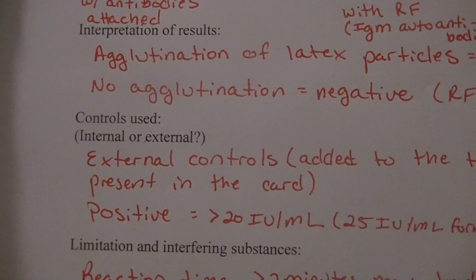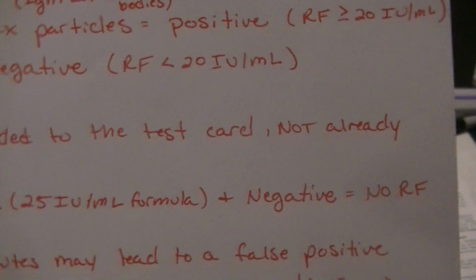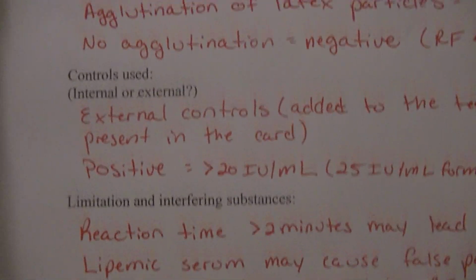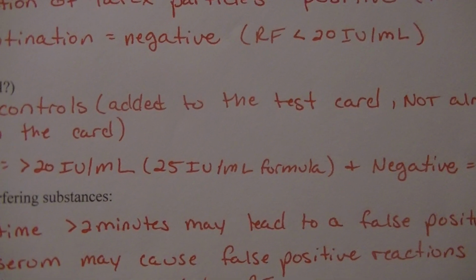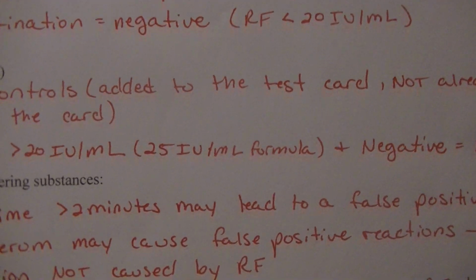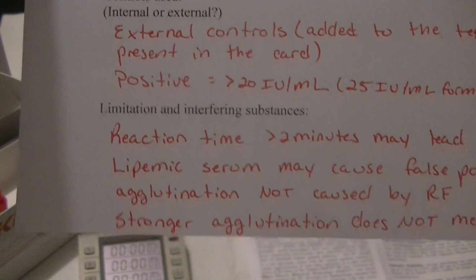Controls that are used. We used what are called external controls because the controls had to be added to the test card. They were not already present in the card when it was produced. Positive control, greater than 20 international units per ml. Specifically in this kit, there are 25 units of rheumatoid factor in the positive control, and the negative control has no RF, so it gives us a negative result.